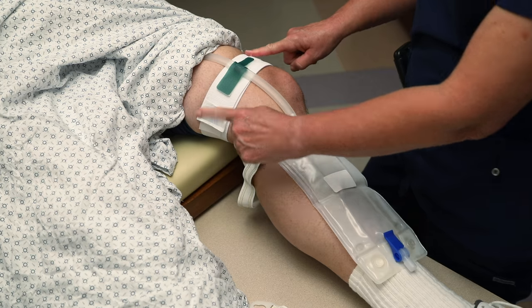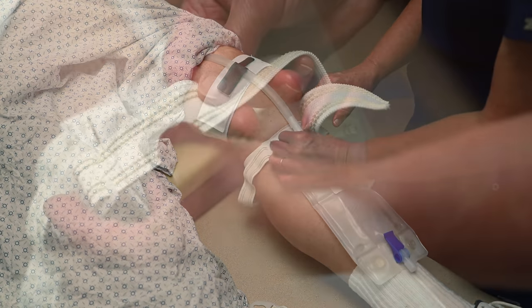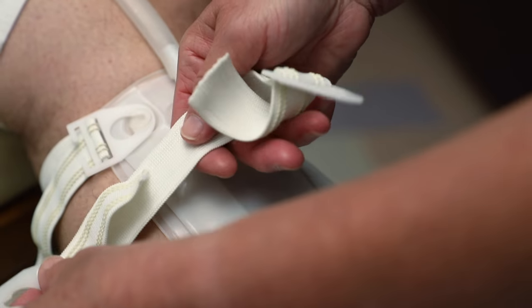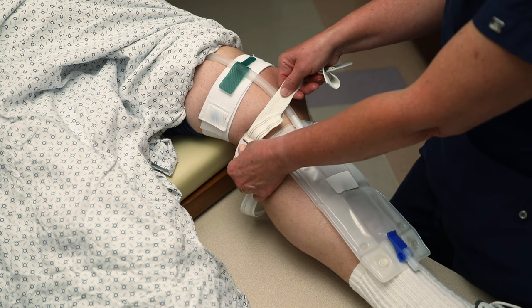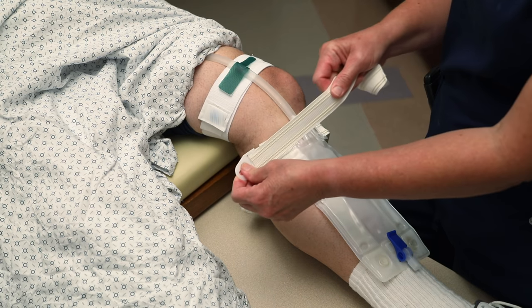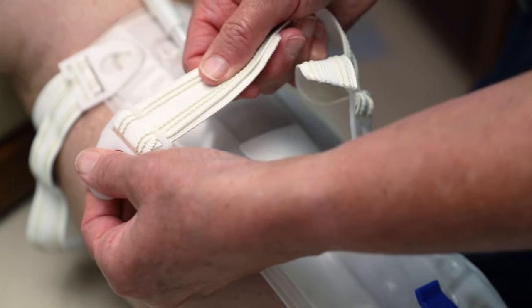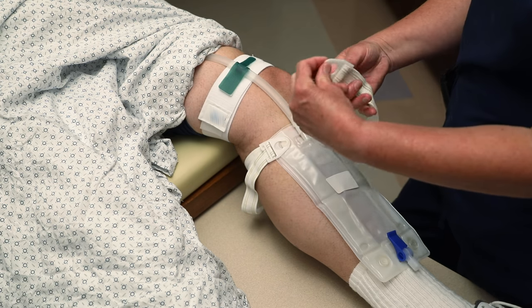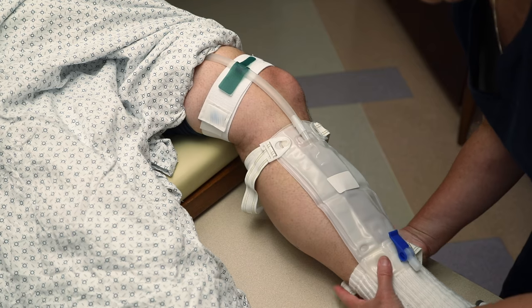When using a leg bag, it is important that the leg straps be secured properly in place. The strap has a textured side to help the strap stay in place — place the textured side against your skin. Adjust the length of the leg strap to fit your leg, then lock the strap into position. This will prevent the strap from getting longer as the bag fills with urine, causing pulling on the catheter.